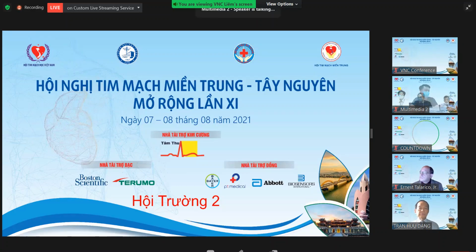Thank you. So 3D speckle-tracking echocardiography needs a complicated instrument, and we also have to use ECG-gated multi-beat 3D strain. So basically we use the more common 2D speckle-tracking echocardiography. Thank you. Okay.